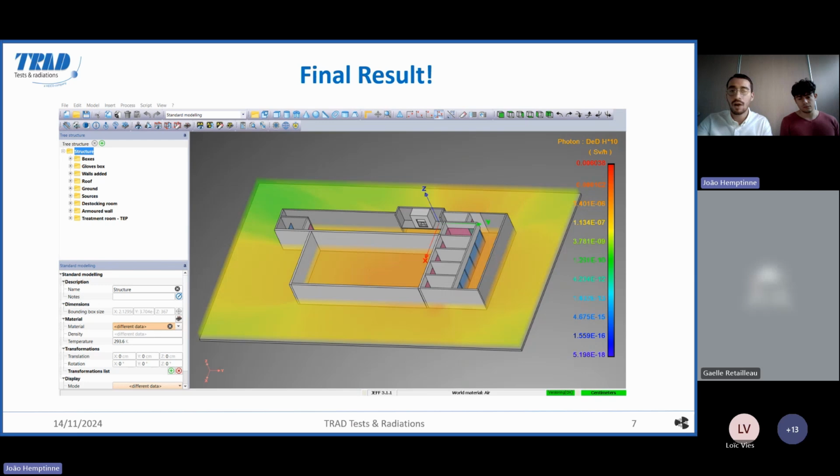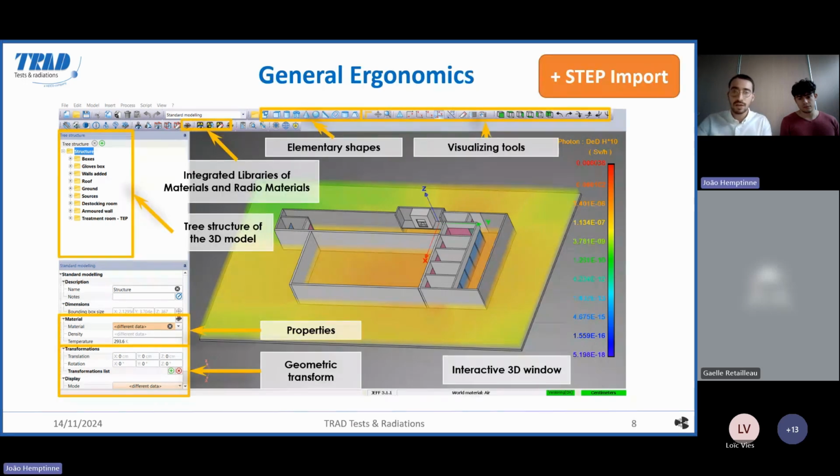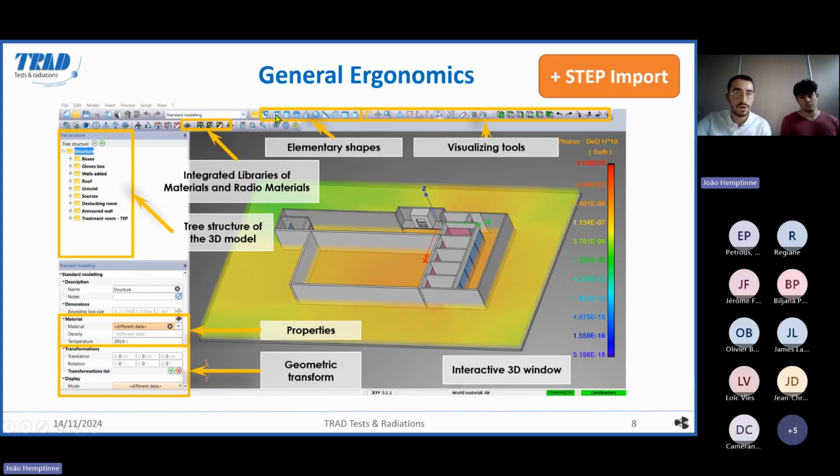This is the final result, but how did we achieve it? Let's start with the basics. You have an interactive 3D window, so you can see what you are modeling. You have buttons to create elementary shapes like a box, a cylinder, cones, spheres, anything you want, and tools to visualize what you are doing. You have options to manage your materials and radio materials, but we'll talk about this a bit later. Here you have the structure of your whole model, so you can see all the elements and organize them in folders. Every time you click on an element, you have the details: the name, some notes, the material, and transformations. You have a big range of options.